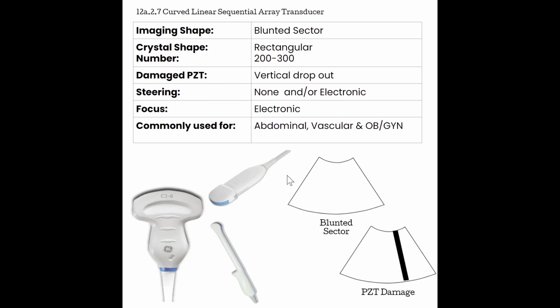So I've got a couple examples of transducers down here on the bottom. This is probably the one that most people associate with ultrasound. This is our curvilinear transducer. If we were to look at the surface of the transducer here, we would see all of those tiny little rectangular crystals aligned, matching up with the curve of the transducer face. We also have other types of curvatures that are a little bit more steep, and these are called microconvex transducers. That's because they have a very small footprint and a really tight curve. And these types of transducers are going to prove very useful in certain applications.